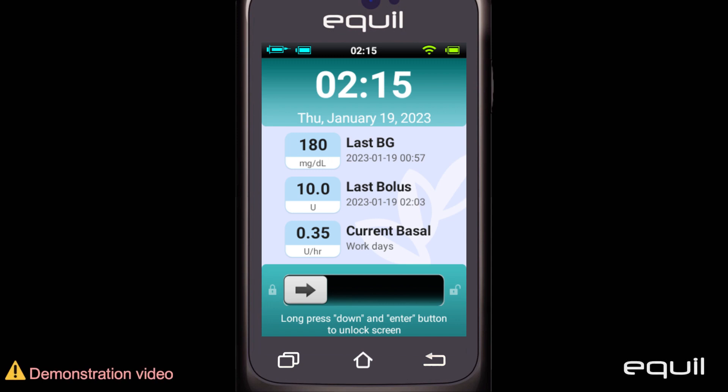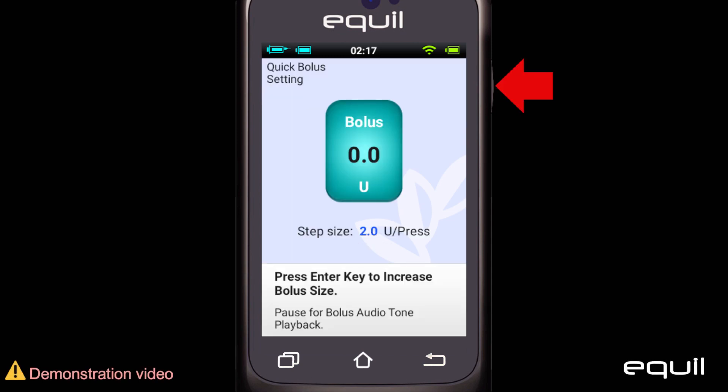Similarly, you can use the Enter button on the PDA to administer a quick bolus instead of the patch pump's bolus button.